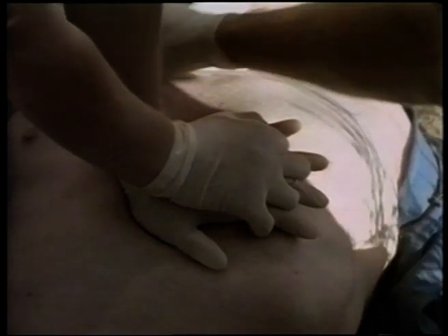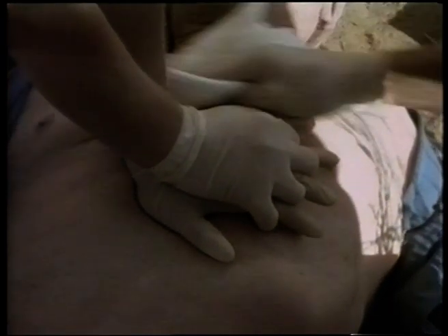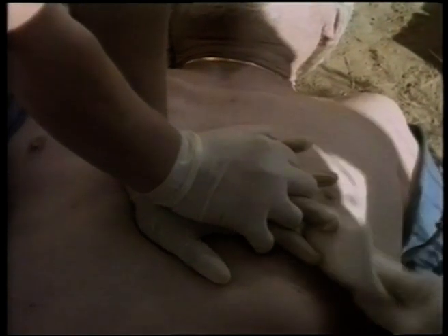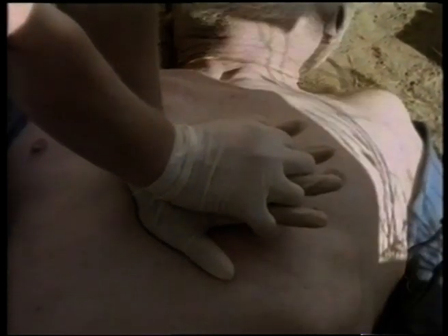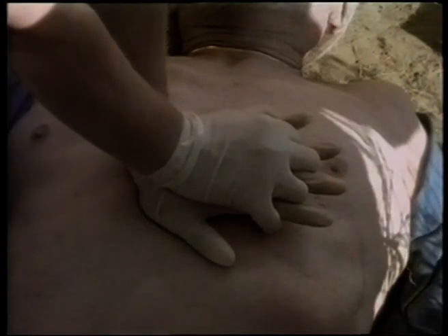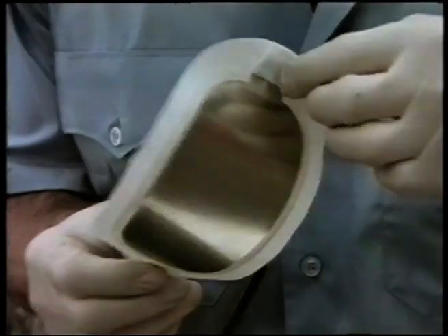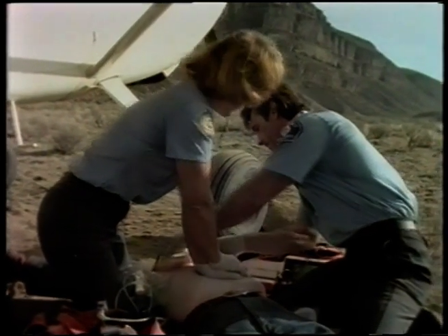Here you see the EMT wiping the chest dry with a towel or discarded clothing. This skin preparation is essential for effective electrode adhesion. If the patient has excessive hair, you may need to shave or clip the hair before electrode placement. Peel off the protective backing from the electrode. Peel slowly, as you see here, to prevent damage to the adhesive gel.